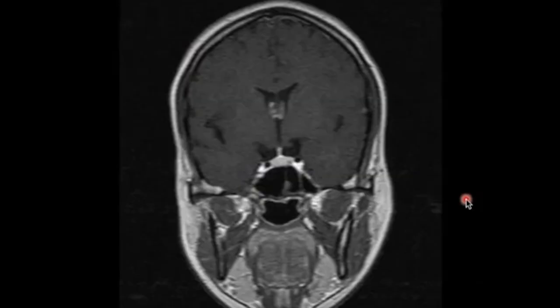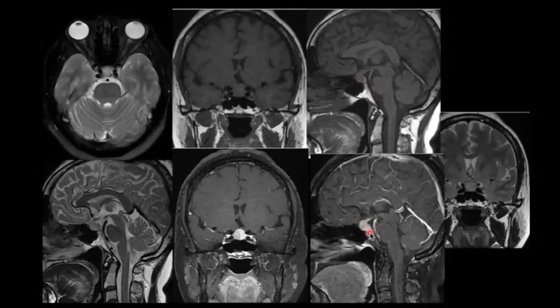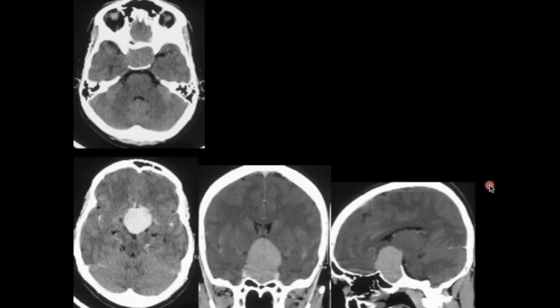Here we have a 27-year-old female with a tiny microadenoma on the left side of the adenohypophysis. Then a 51-year-old lady with headache: the sella is mildly enlarged and the adenohypophysis is bulky, measuring more than 1 cm in height — this is a macroadenoma. For this patient the dynamic sequence is not needed. For a postmenopausal woman, anything above 8 mm is abnormal; this lesion is just abutting the optic chiasm.